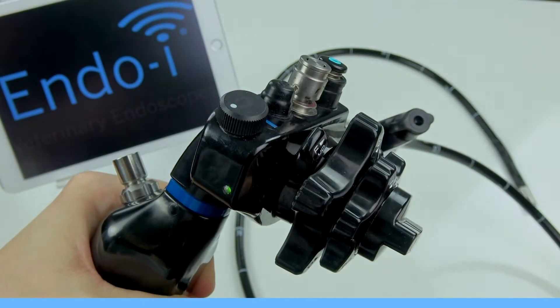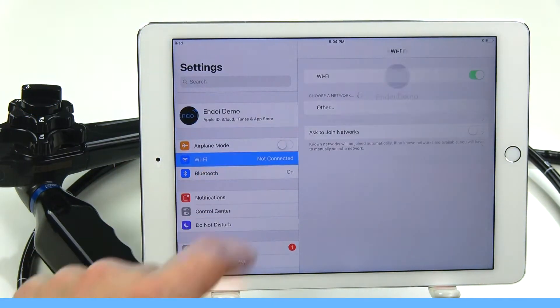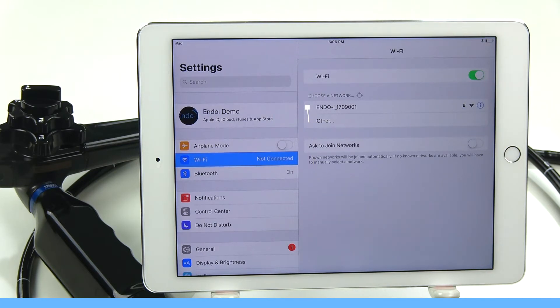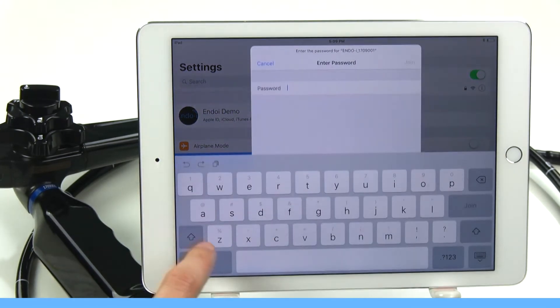First, turn on your EndoI. Now go back into Settings on your tablet and click Wi-Fi. After a moment, your EndoI will show as a discoverable device and will be listed by its serial number — in this case, EndoI 1709001. Select the EndoI in the available Wi-Fi networks.